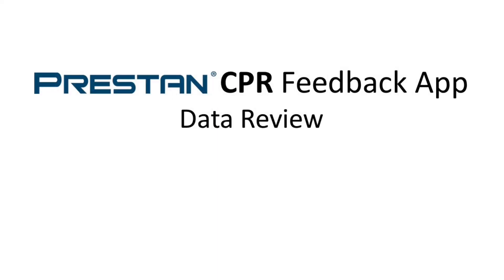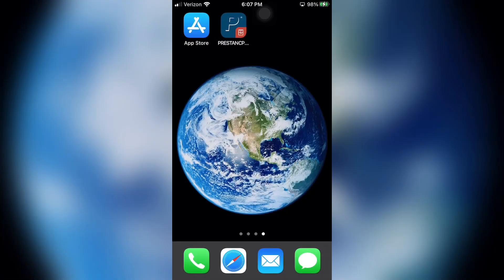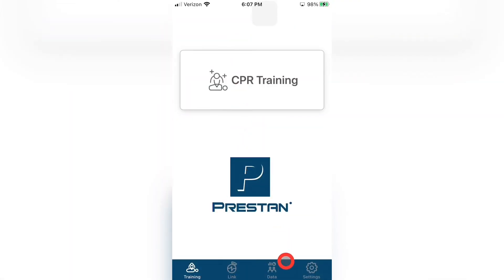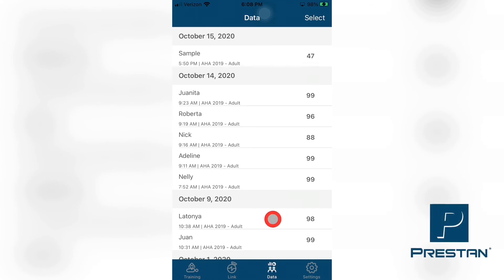Prestan CPR Feedback App — Data Review. The detailed data for each student in your training session is recorded and stored in the Prestan CPR Feedback App. This data can be retrieved immediately at the end of each training session, or it can be retrieved at a later time for review and documentation of the results. To retrieve the detailed data, select the Data tab at the bottom of the screen. This will bring up a list of all the historical data that has been collected from your training sessions. The overall list shows the name of the mannequins, or in the case where you temporarily renamed the mannequin, it would show the student name instead.